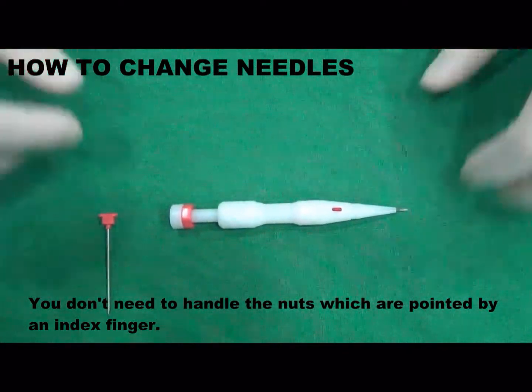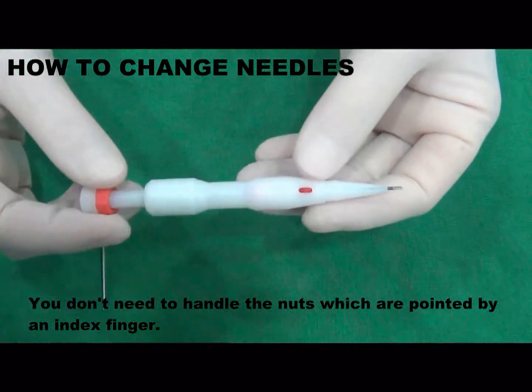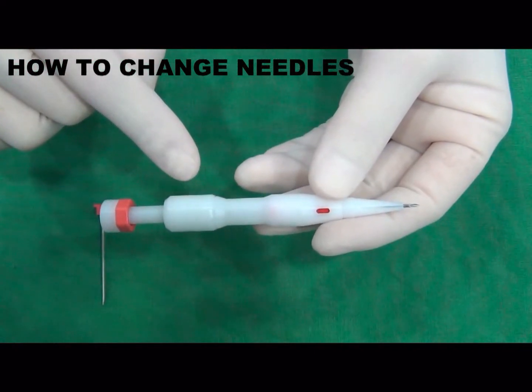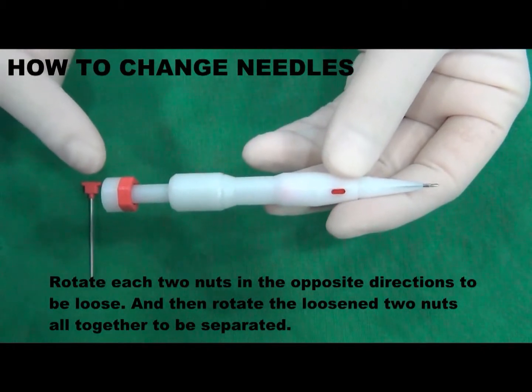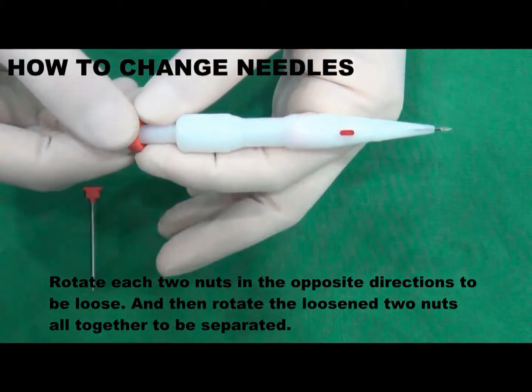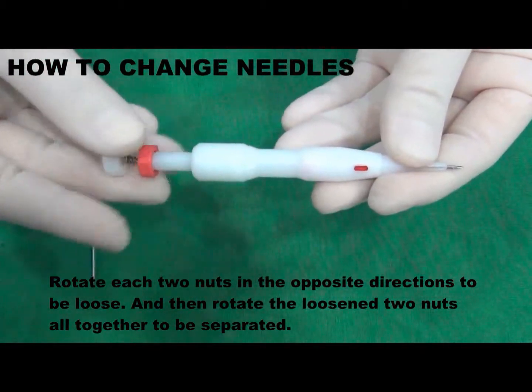You don't need to handle the nuts which are pointed by an index finger. Rotate each two nuts in the opposite directions to be loose, and then rotate the loosened two nuts all together to be separated.